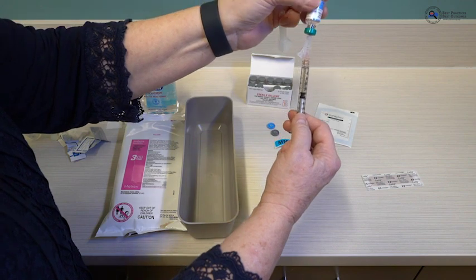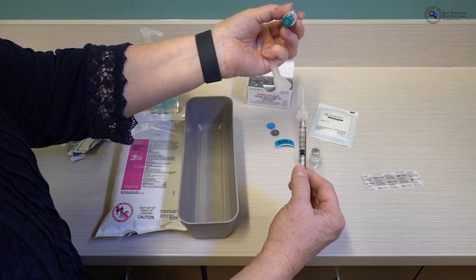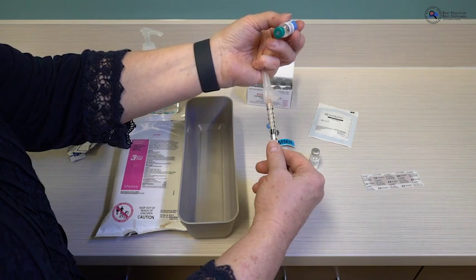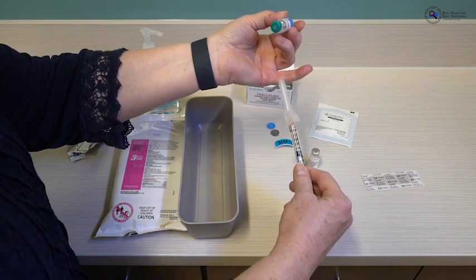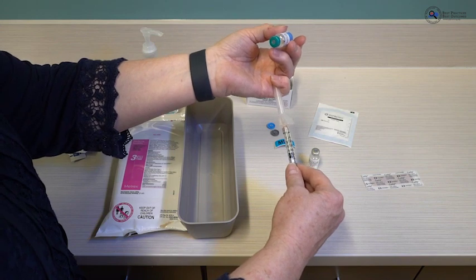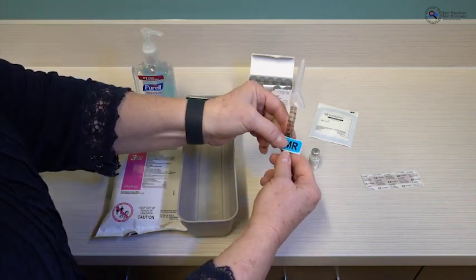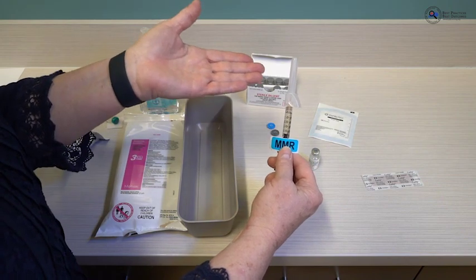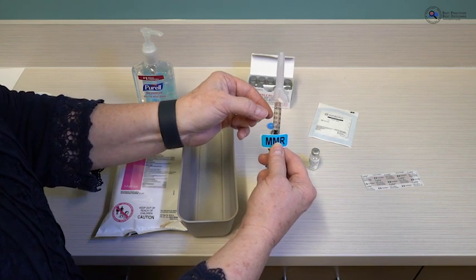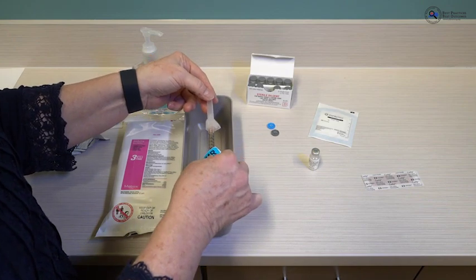Inspect the syringe to make sure there is no air, then pull it out of the vial. You should see 0.5 cc's and no air. This is a clean needle — not yet used on a patient — so you can recap it using a one-handed scoop method or however you have learned, just making sure not to contaminate the needle. If you do contaminate it, you must discard the entire vaccine, not just change the needle. Apply a label to the syringe — never leave a syringe unlabeled — and because this is a time-sensitive live vaccine, record the time of preparation. Place it in a container ready to transport to your patient.